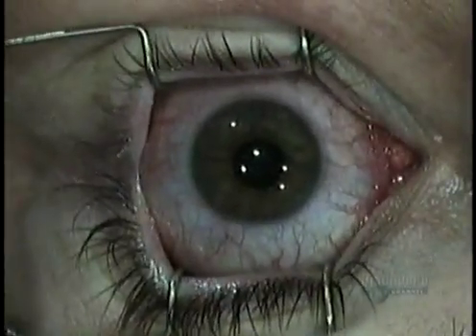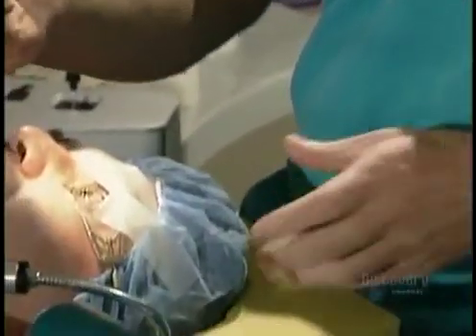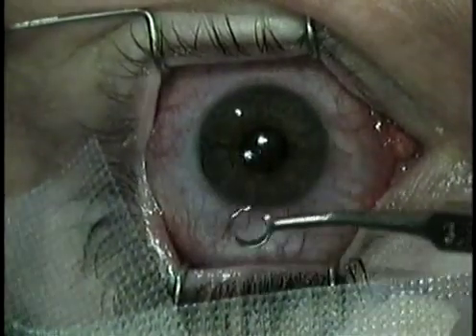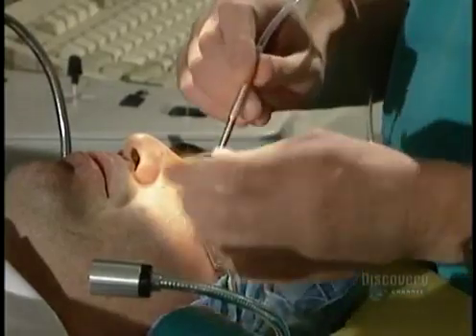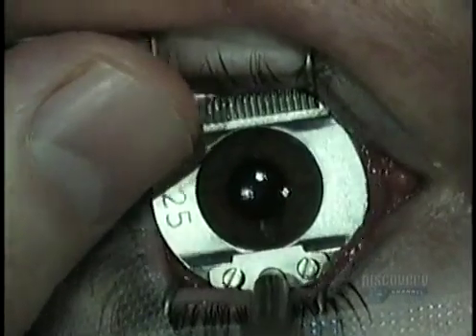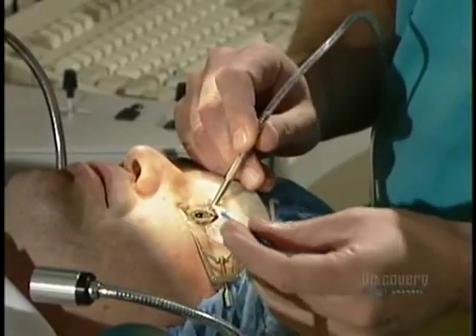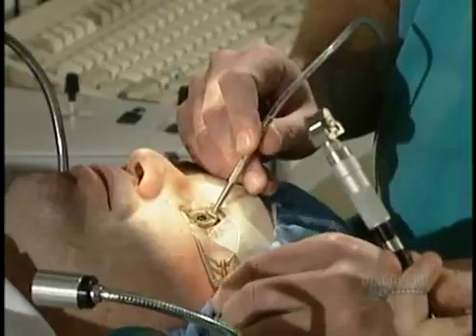The surgeon uses the speculum again to prop the lid open, then begins the operation. He marks the eye with sterile ink — reference marks he'll use later. Next, he positions a metal ring around the cornea. The ring is attached to a suction pump so it clings to the eye. Like holding a tomato steady while you slice it, it holds the eye steady while the surgeon cuts the tissue. The surgeon lubricates the eye with sterile water, then mops up the excess water with a small absorbent sponge.